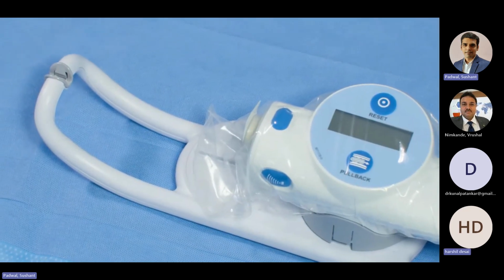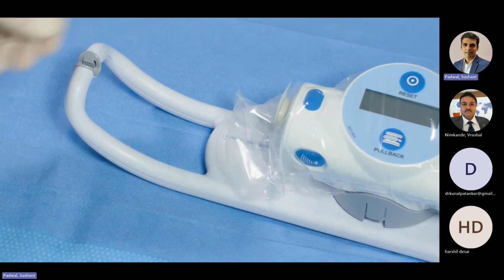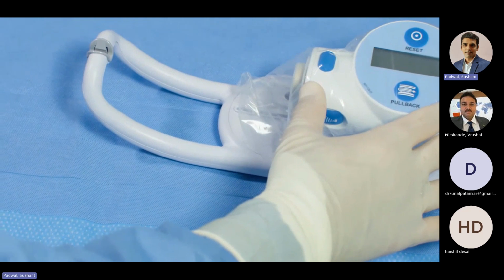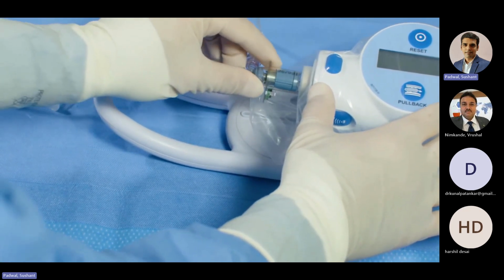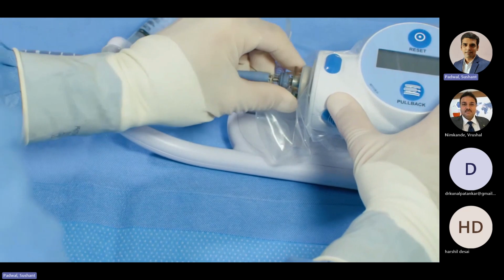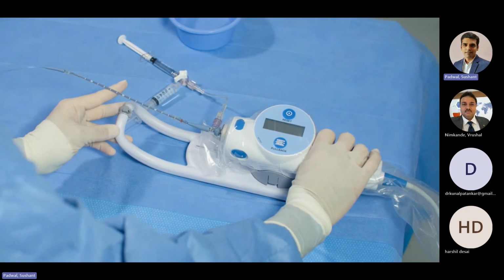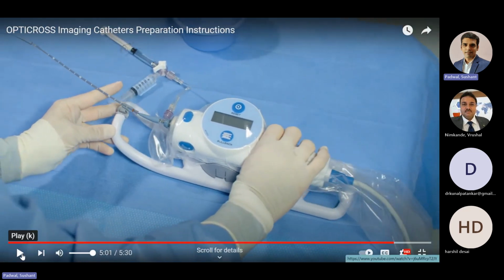Connect the imaging catheter to the sterile bagged motor drive. Remove the seal and insert the catheter until it audibly clicks into place. Press and hold the pullback release lever and carefully move the motor drive. See how the operator is moving the MDU forward by holding the catheter a bit away so that it doesn't kink and doesn't damage the catheter.